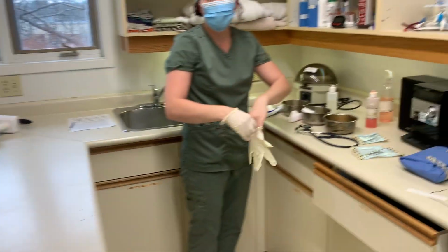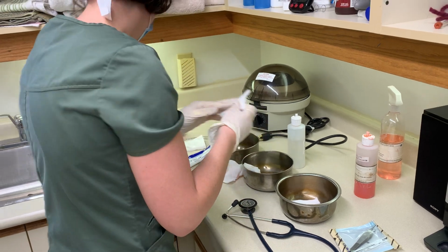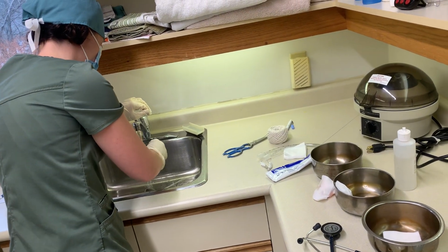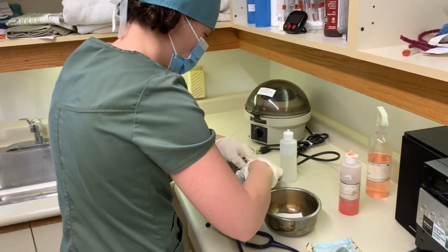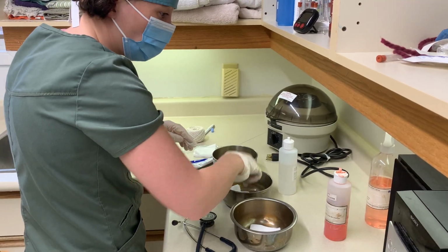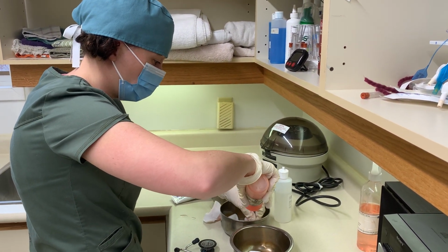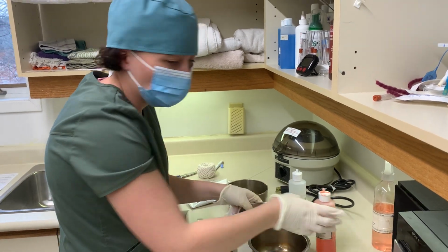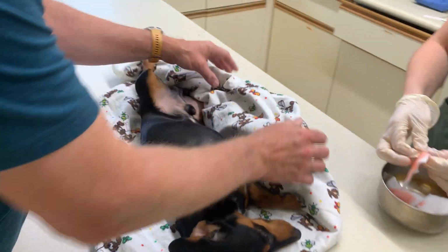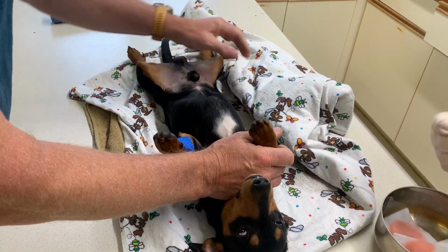Okay, so we're going to start by doing a target technique. So I'm going to take chlorhexidine here with 3 gauze squares. Make sure your water's warm because you don't want your patient getting cold. And then again, I'll just have a little bit of warm water on these squares here. Now, chlorhexidine goes on top of those squares. And we're going to start by doing our target technique. So I need our patient to roll back into a dorsal recumbency. And I'm going to take my squares like this.